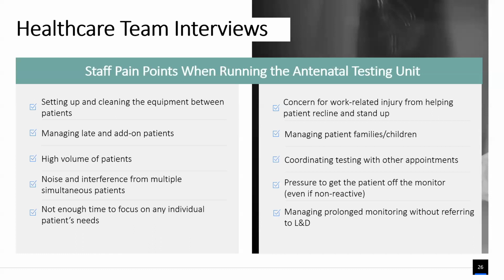And finally, some patients need prolonged monitoring. We've all had situations, it probably happens every day in the busier units. The fetus looks great on the monitor, but it has an isolated variable deceleration for 60 seconds or so. Well, I think the baby's fine, but I want more time. I want to be able to keep that baby on the monitor for, let's say, a half hour to make sure that it's reactive and it's not a recurring thing, it's an isolated thing. But I can't do that in my office because I have 5 more patients waiting for that bed.